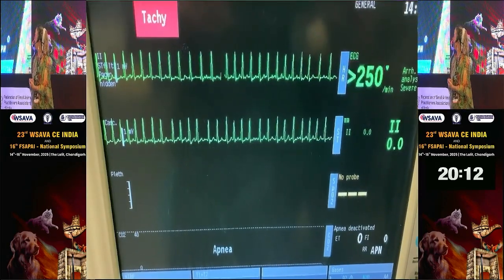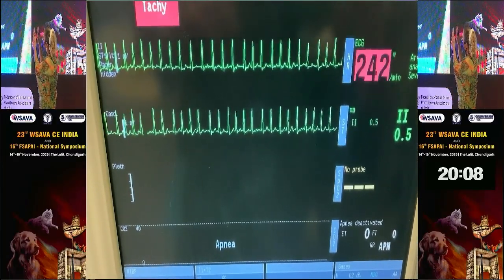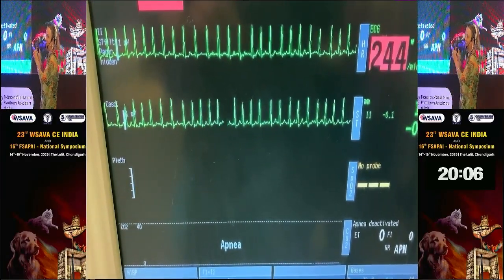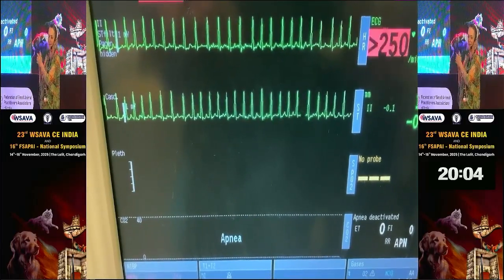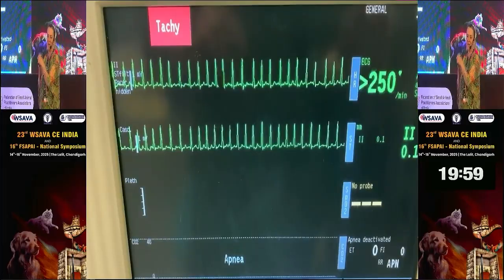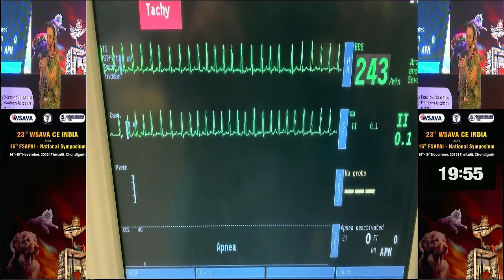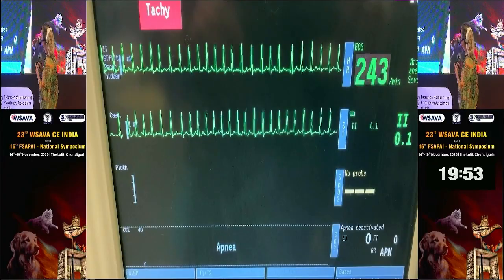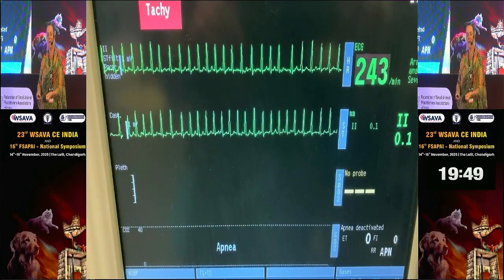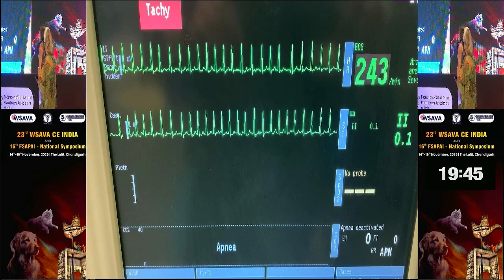So this is one that's quite fast, but if you watch carefully, see how you start seeing variations. And this is me eyeballing it without even getting the paper off and measuring. It does it again up here. It gets a bit more obvious where you get quite a different, wider complex there between your RR intervals. But if you listen to this dog as well and felt the pulses, there are pulse deficits. It sounds really irregular is the best way to describe it.